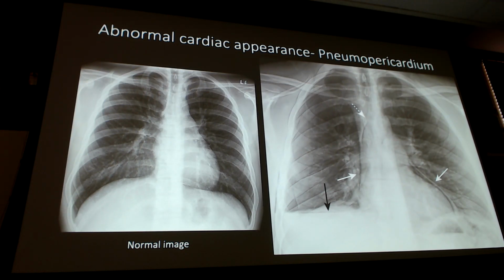Yep, and then I will buy potentially as well this guy right here and right above it. Potentially. Hard to tell because it's right behind the rib a little bit, but I do have that thoracic shaped kind of line, and I have no lung markings up here, and then this one here I have right here for sure, and no lung markings up here.